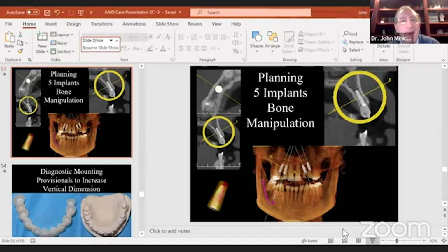How did you deal with the inclined occlusal plane of 32? I don't think I even dealt with the occlusal plane of 32 because I opened up the occlusion. And I think that was not a problem at all. I don't think that tooth is in occlusion. I'd have to look at the x-rays, but it was a negative factor. I don't know if I even did the implant on number 30 yet on her lower, or I may have replaced number 30. How did you deal with the inclined occlusal plane of number 30? Okay. And that's it.